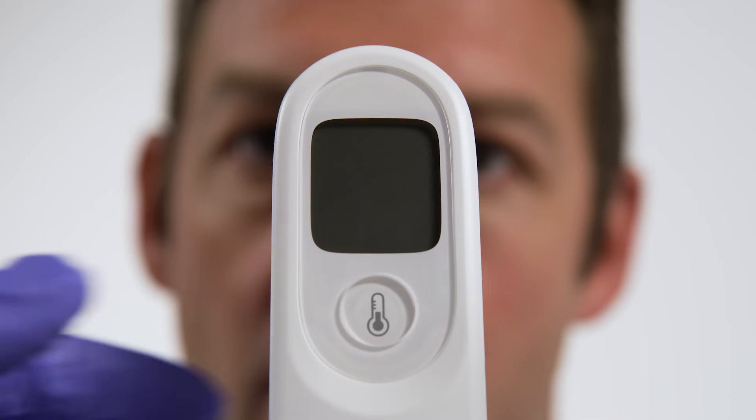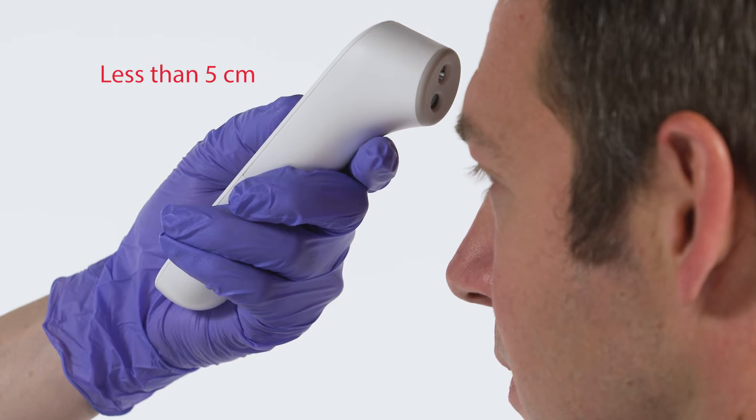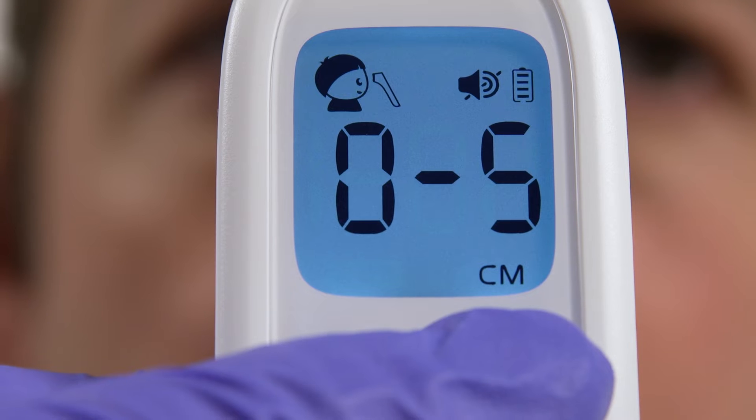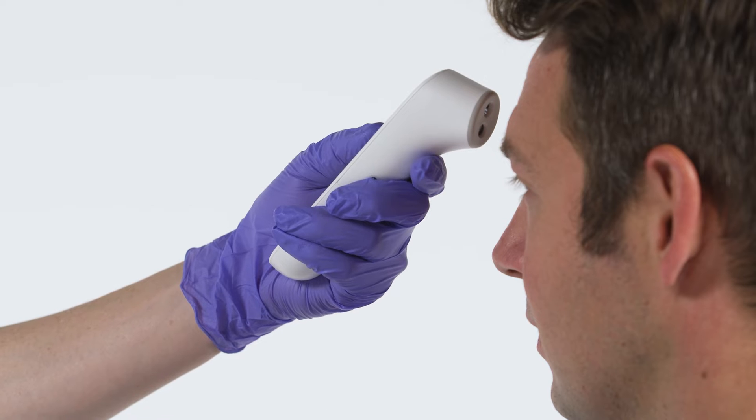To take a reading with the NCIT, point the device probe at the center of the eyebrows and keep a distance of less than 5 centimeters from the patient's forehead. If the provider is too far away, the thermometer will beep to alert them to adjust the distance so a proper reading can be taken.